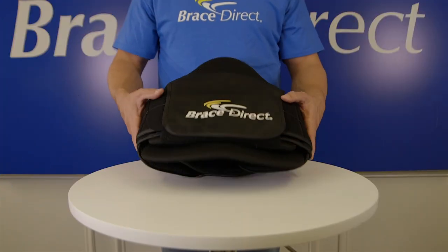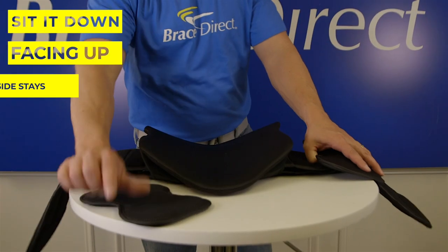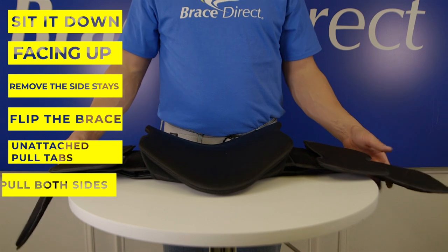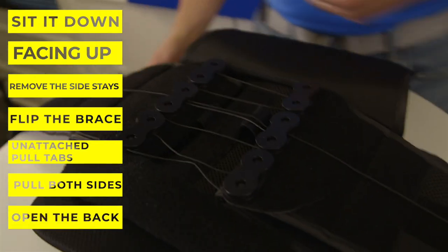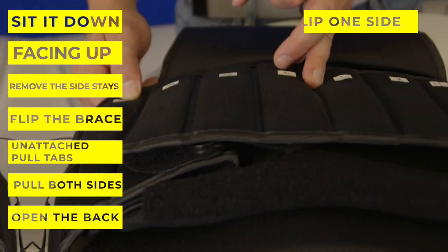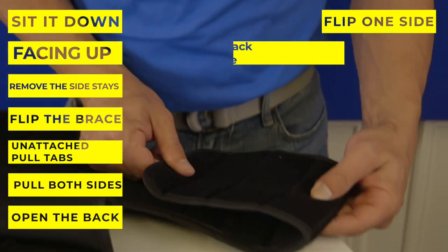To fit this brace, set it down facing up and remove the side stays. Flip the brace over and unattach the pull tabs from the body of the brace and pull both sides. Open the back by pulling the bottom velcro loose, exposing the pulley system. Flip one side of the belt over showing you the size guide, then close the back of the brace.